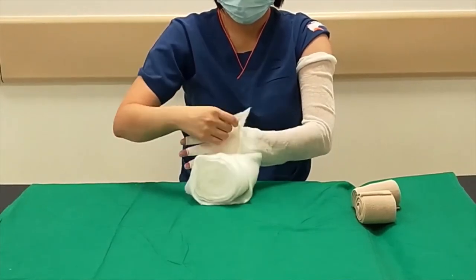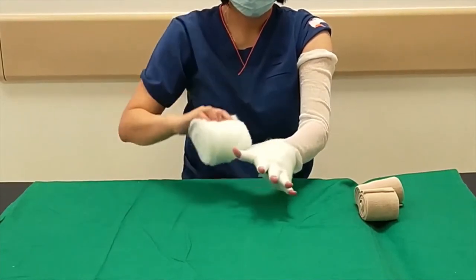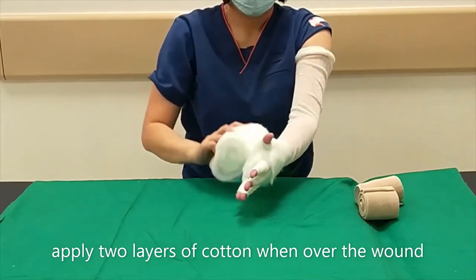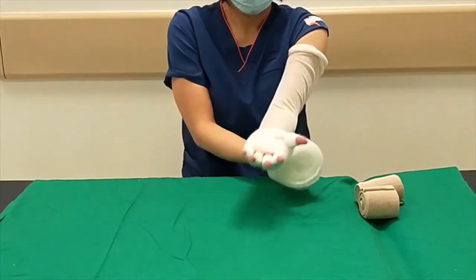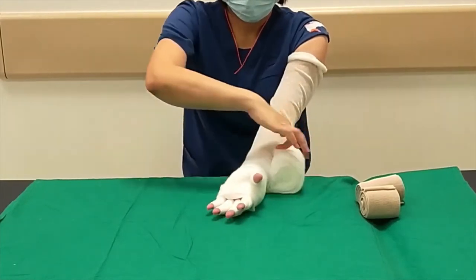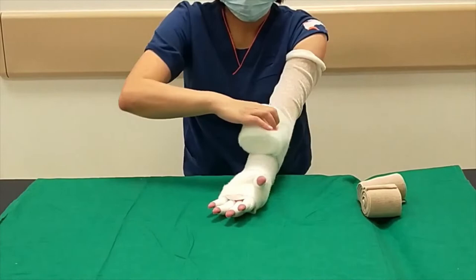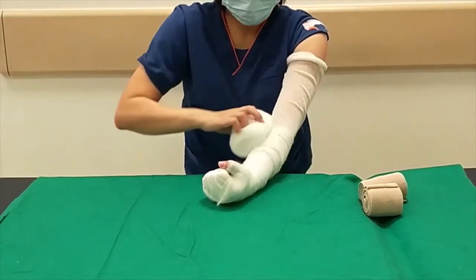Wrap the cotton over the back of the hand. Spread the fingers and make sure to apply 2 layers of cotton over the wound to provide more padding. Continue wrapping the cotton up the hand.